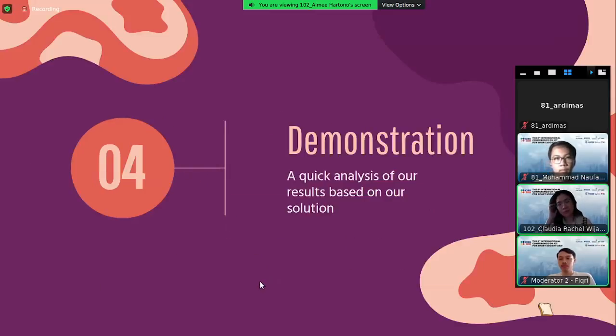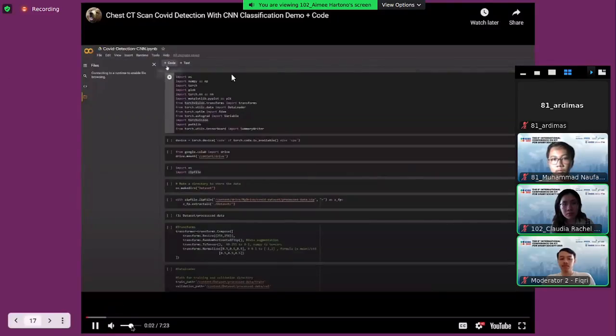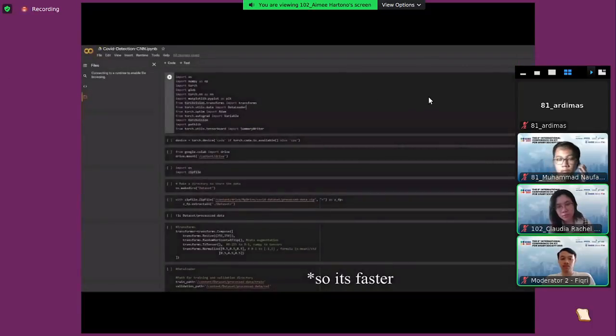So let's move on to the demonstrations and the results section. I will play a video provided by one of the authors of this paper to showcase our CNN model. This is a demo for testing the COVID detection using CNN. I'm using Google Colab. You want to make sure your runtime is on GPU. And let's run the code.